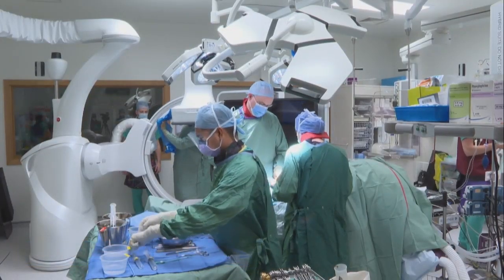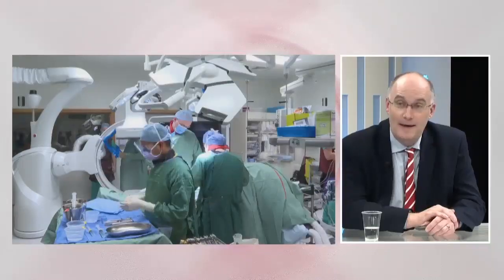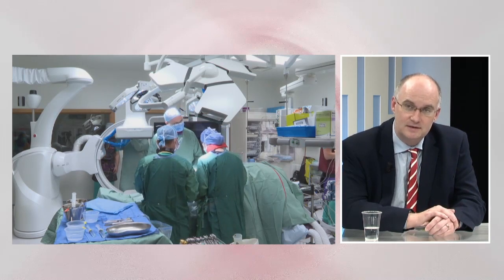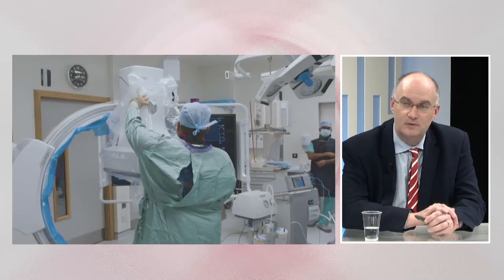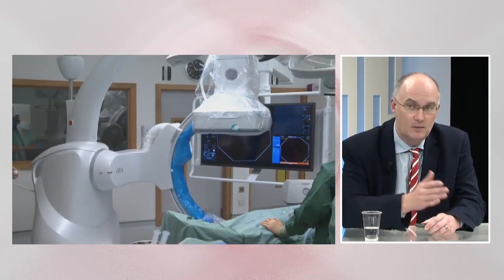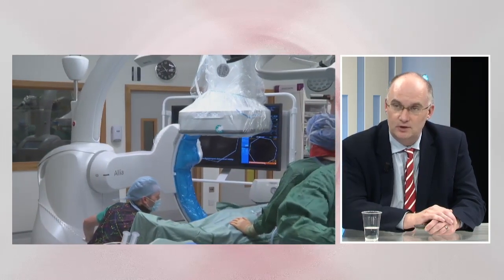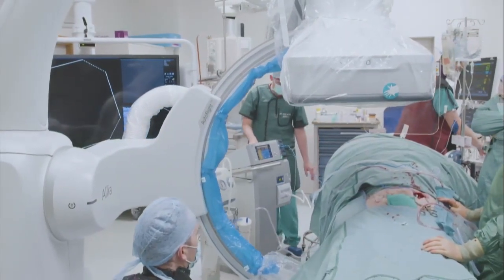Our operating room in Galway is quite a bit smaller than those in the United States. From our point of view, the Alia system sits beautifully off to one side when not in use, which was very important because this theatre is also used by other specialties. It has to function as a fully functional open theatre as well. As you can see, it swings in very quickly and we can go into endovascular mode in about 30 seconds with no real time delay.